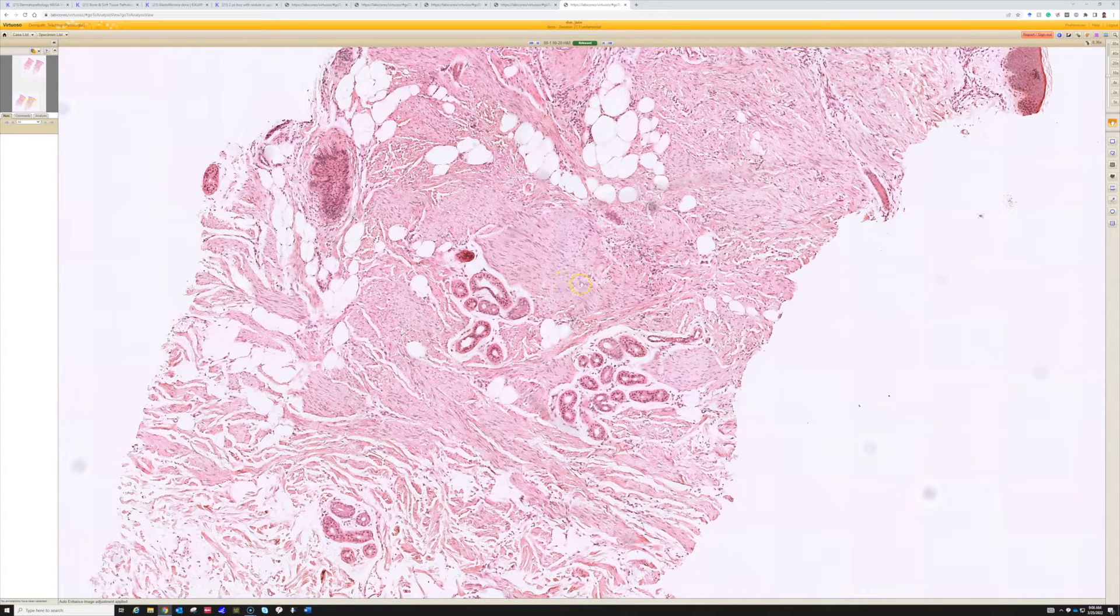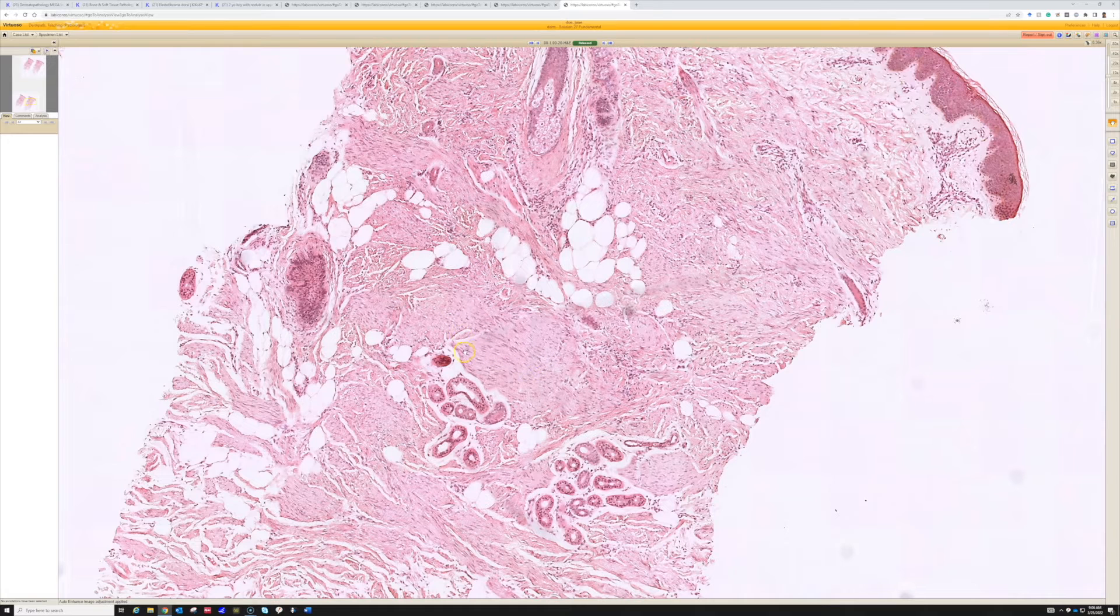And because of that, you could think about dermatofibrosarcoma protuberans, although I've seen a lot of DFSPs, and I've never seen a DFSP that has this pattern of fascicles of hypocellular cells. DFSP can get fascicles that intersect when it becomes higher grade and fibrosarcomatous, but it's going to be very cellular and blue and closely packed cells when it does that, very different from this.